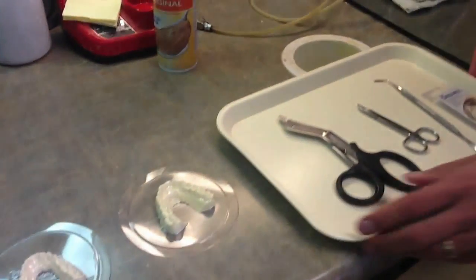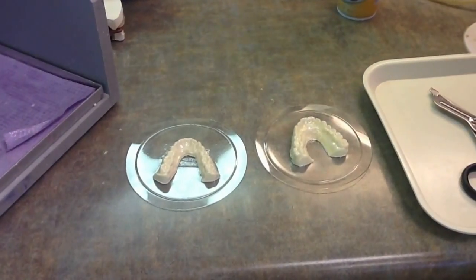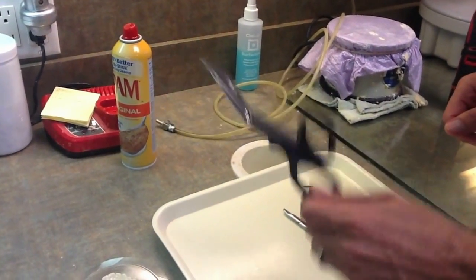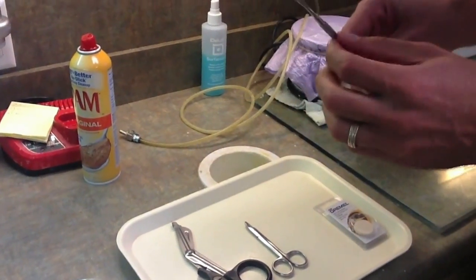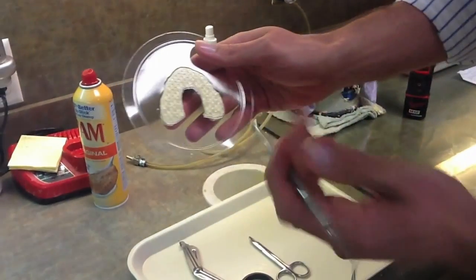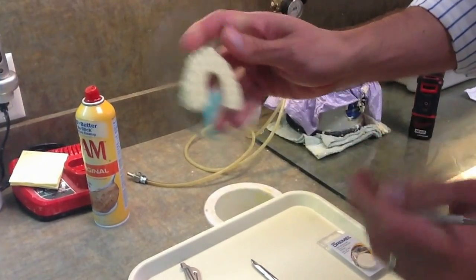We generally use a few instruments when separating the models from the plastic. The first are these black handle scissors from Dent Supply. We also use regular plastic cutting scissors, and this beaver tail instrument that you can wedge in between the plastic and the model to help displace the model out of the tray.